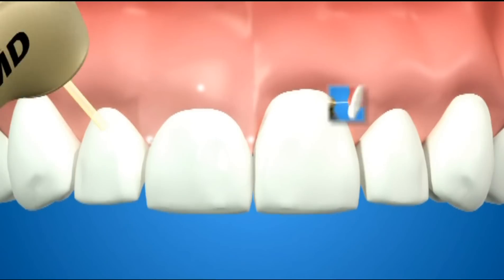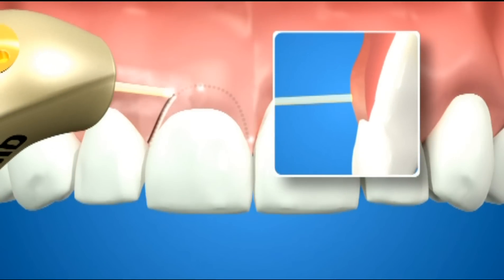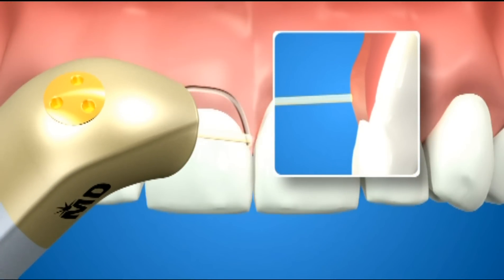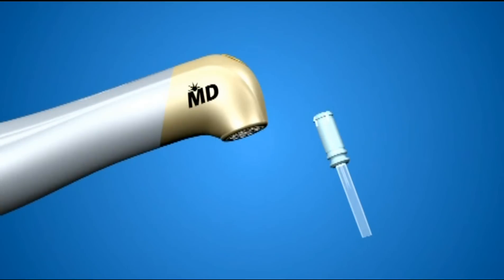For thick fibrotic gingival biotypes, use the full thickness technique. Angle the tip at 90 degrees while moving across and down to achieve a full thickness incision.